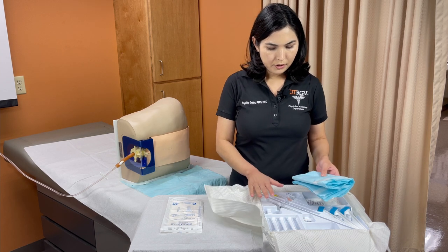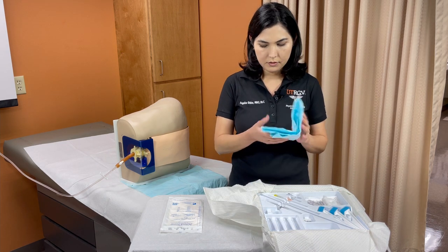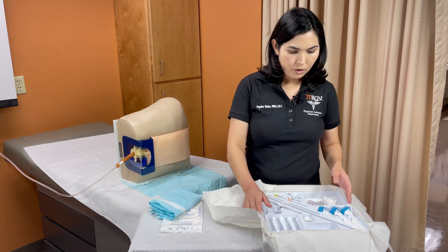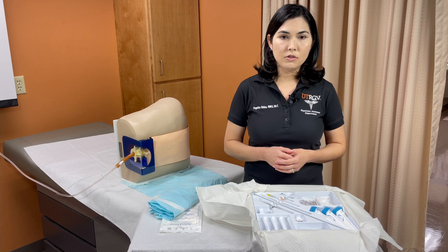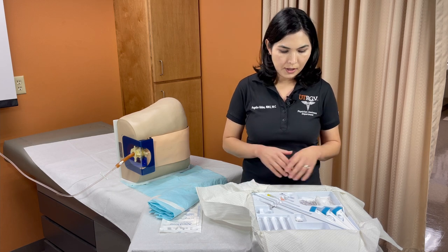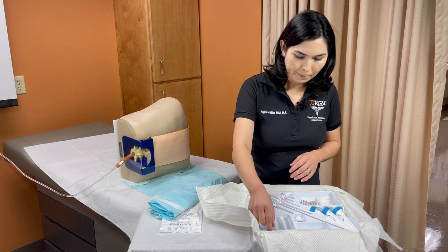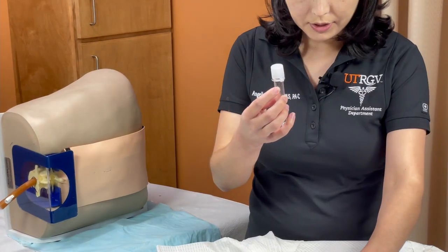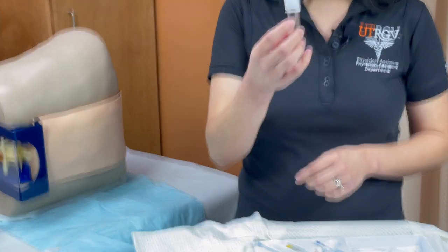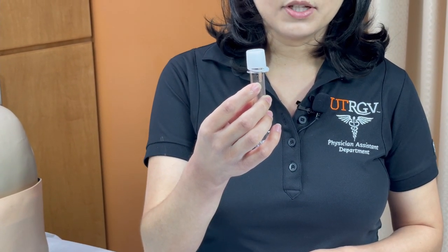In your kit, you will have a fenestrated drape. You will have your four numbered collection tubes — ordered one through four. You have your spinal needle — this kit comes with a 22 gauge cutting needle, similar to a Quincke. Other types of spinal needles like a Sprotte or Whitacre are atraumatic and shown to reduce the incidence of post-dural puncture headache, which is one of the most common complications.